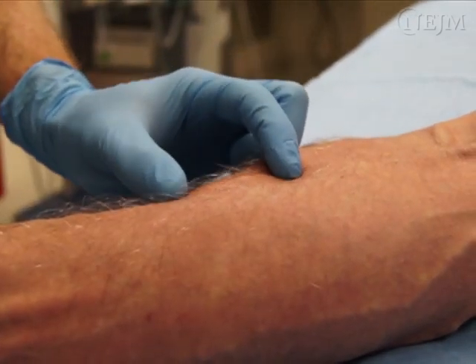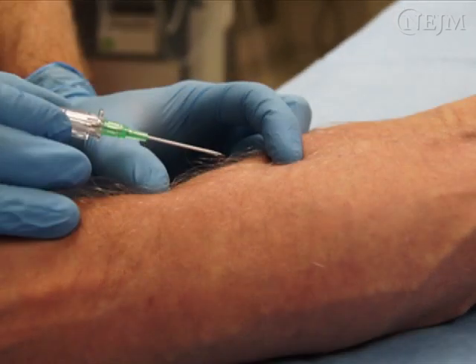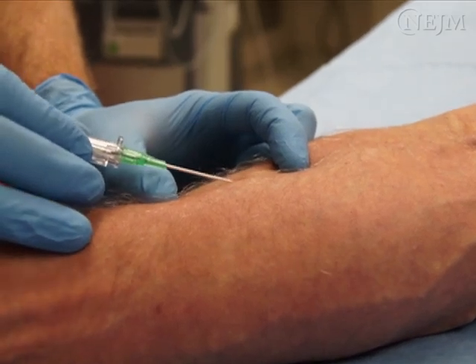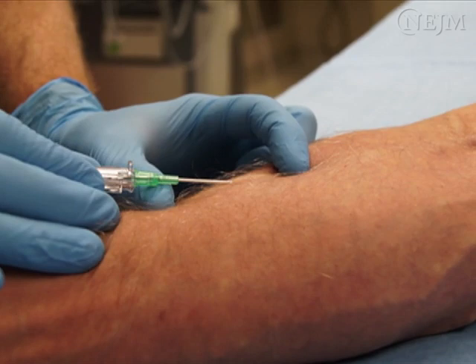Stabilize the vein with the fingertips of your non-dominant hand. Hold the needle with your dominant hand between your thumb and index finger. Make sure the bevel is pointed up. The needle approach should be along the course of the vein at an angle of 10 to 30 degrees to the patient's skin. Puncture the skin and then the vein with a quick forward motion so the needle tip penetrates the wall of the vein instead of just pushing it aside.